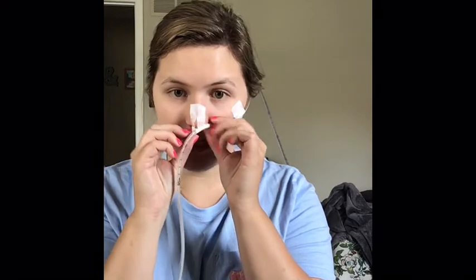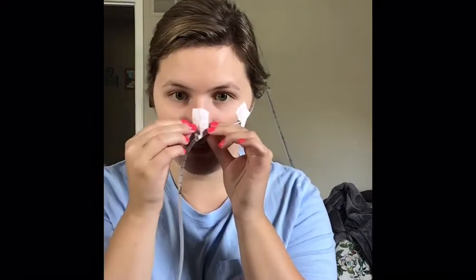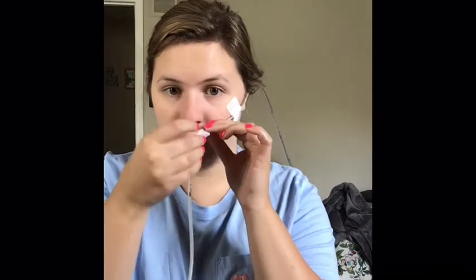I'm not going to because, you know. So once that's in, I'm going to take this tape off because it's hard to talk. I'm just going to pretend that it's there. Okay, so I'm going to go ahead and listen to my patient's lung sounds just to make sure I don't hear anything abnormal from my baseline. And then, like I said, it's secured, send my patient down for a KUB. I'm not going to hook it up to suction. I'm not going to do anything until I get this KUB done.